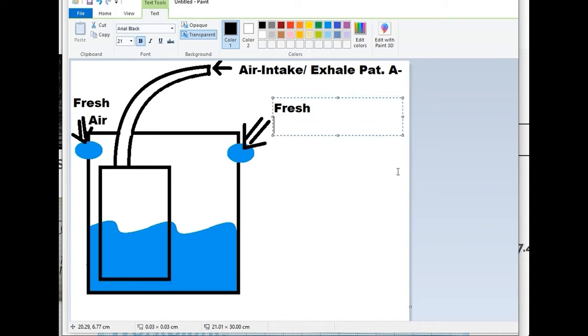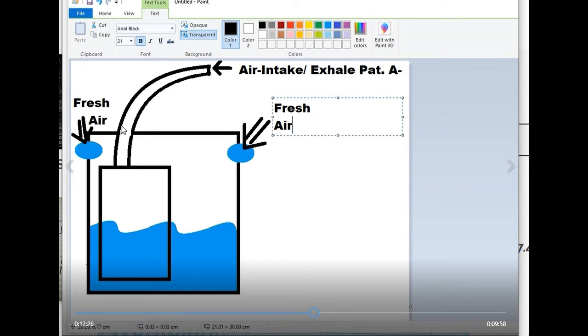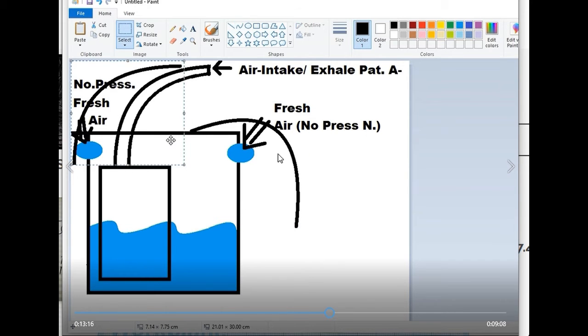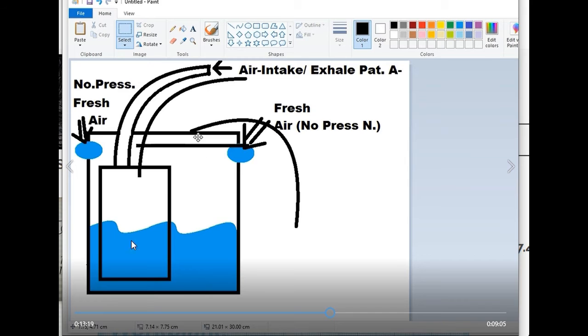So the fresh air, as I say, is from the valves here. Then here it doesn't need pressure because this air gets soaked in by this. When it's empty, it sinks, and by that it has a weight. It soaks in the air by its weight.